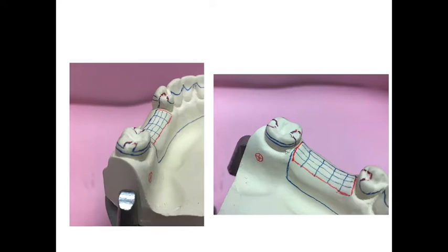You can see the ring clasp can go this way or the other way. When you know how to use ring and circumferential clasps, no matter where the undercut is, you may be able to use a clasp on all the teeth, because you can see on the mesiolingual, on all the areas you can design the clasp.